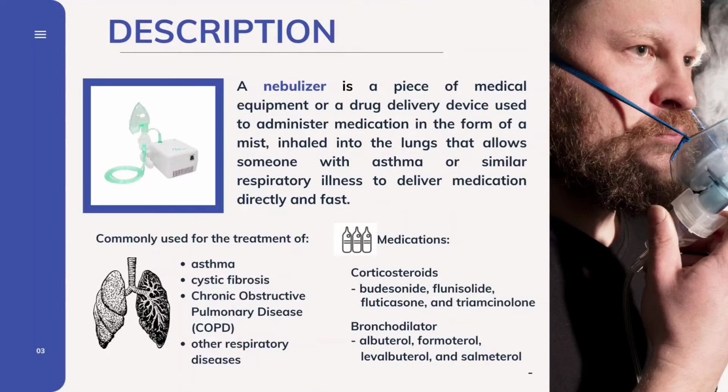A nebulizer is a piece of medical equipment or a drug delivery device used to administer medication in the form of a mist, inhaled into the lungs, that allows someone with asthma or a similar respiratory illness to deliver medication directly and fast. Nebulizers are commonly used for the treatment of asthma, cystic fibrosis, chronic obstructive pulmonary disease or COPD, and other respiratory diseases or disorders.